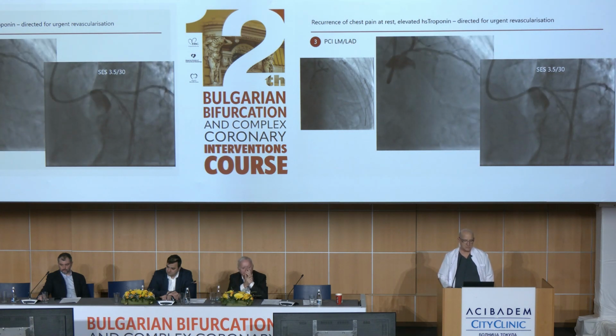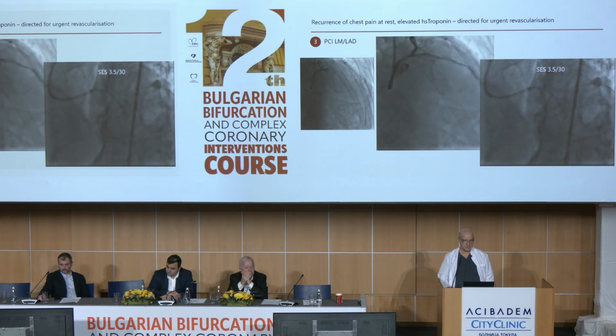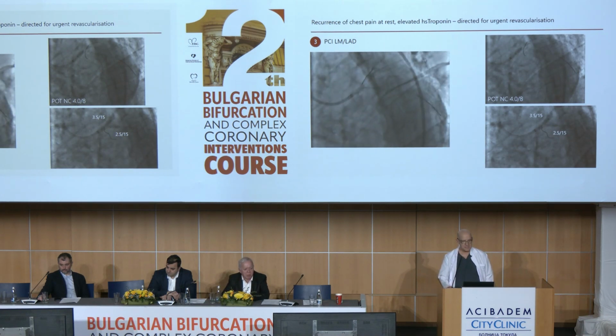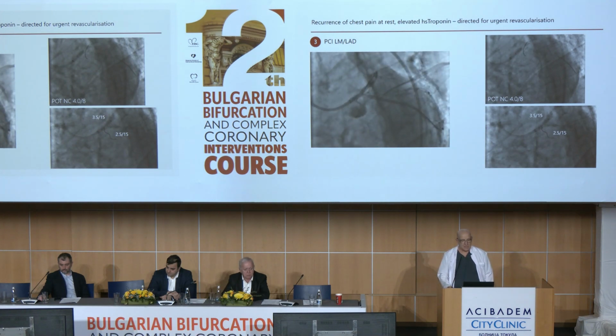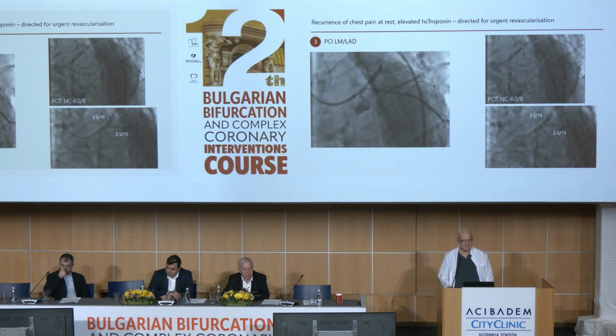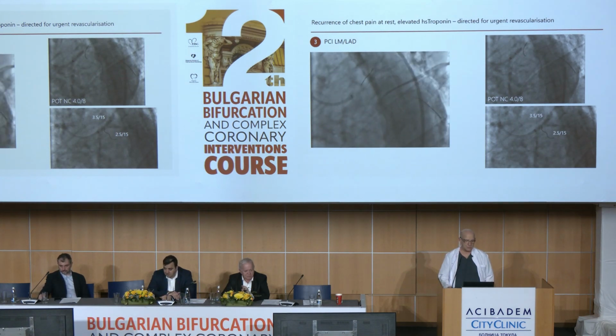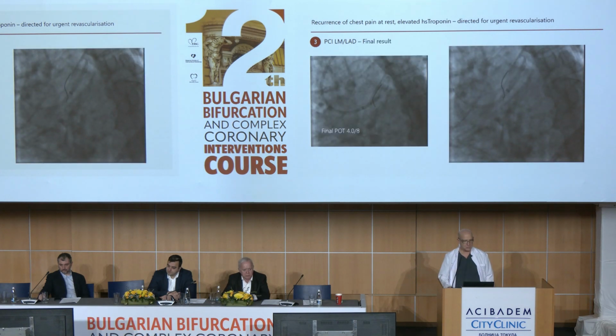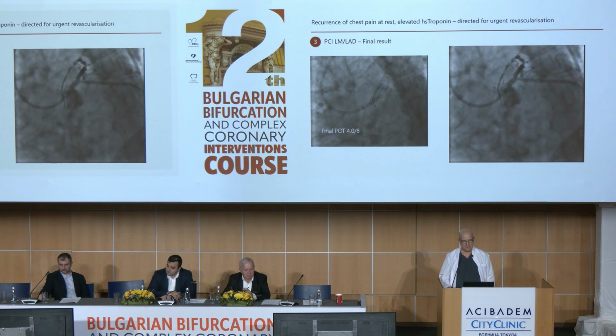You can see it in this position, a caudal cranial view, just putting it at the ostium part of the vessel. We inflated the stent. There was some pinching of this lesion, but as we suggested, it was probably spasm because it disappeared afterwards and is looking much better. 3.5 with NC balloon into the LAD and posterior LAD POT with a 4.0 balloon. Final kiss with 2.5 and 3.5, and finally this was the final result after repeated POT.